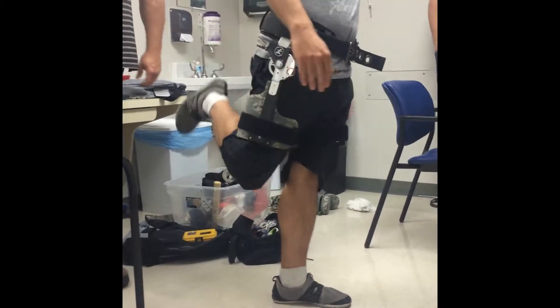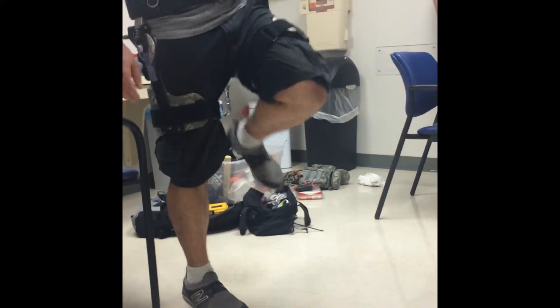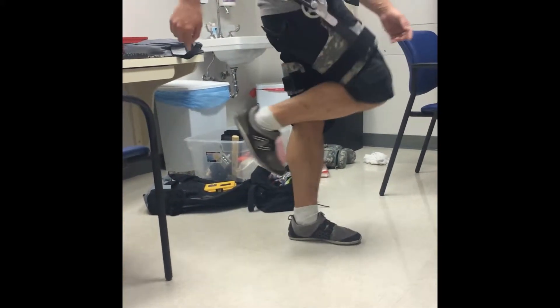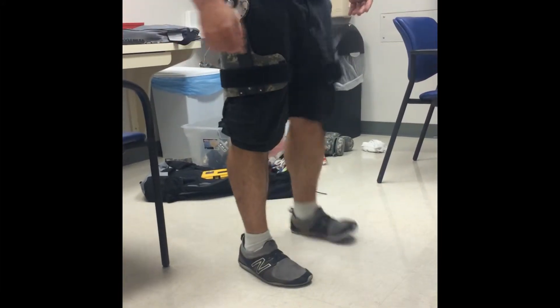Here I am just sort of trying it out and feeling the one that goes all the way up to and around the waist. This company is called Spring Active — they're showing a lot of promise and are actually located up in the Phoenix area. Their original developments were for the military, so we're hoping to bring this into the medical aspects as well.